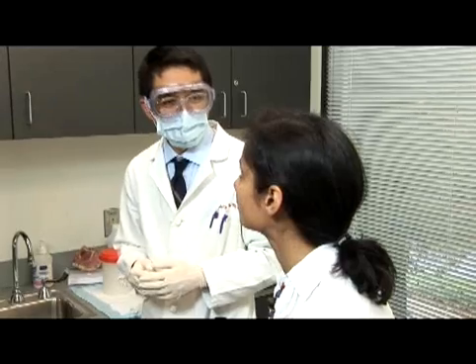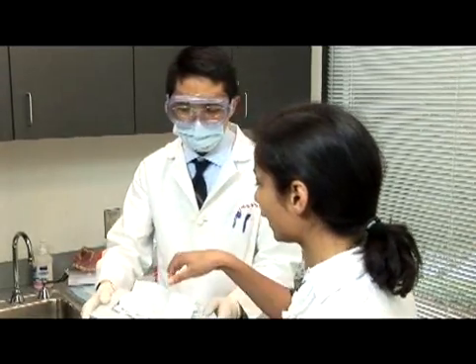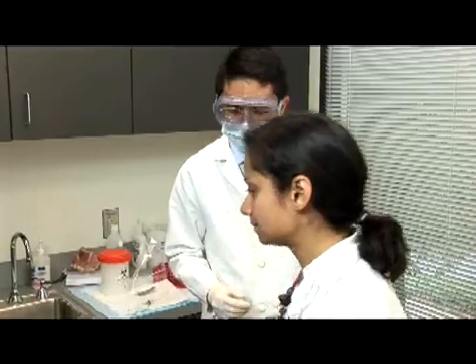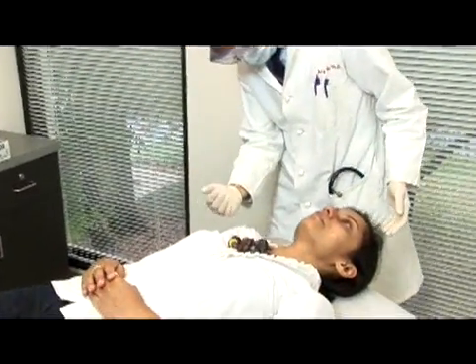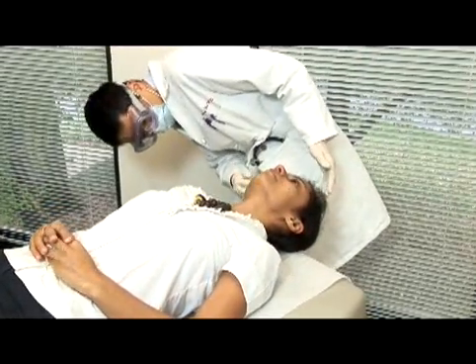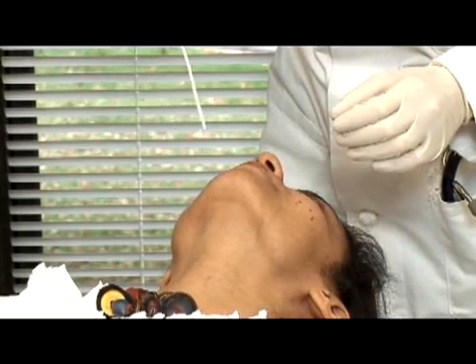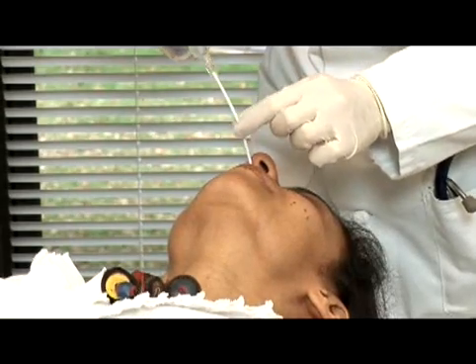Before you begin the procedure, ask the patient if he or she has a deviated septum or nasal obstruction, and have them blow their nose to remove any excess mucus from the nasal cavity. The patient should be in a supine position for specimen collection. The patient's head should be tilted back with their neck extended to allow for the pooling of the aspirate in the nasopharynx. Instruct the patient to hold their breath and not to swallow during the procedure if possible. Tell the patient the procedure will not hurt but may be uncomfortable or cause them to tear or even sneeze.